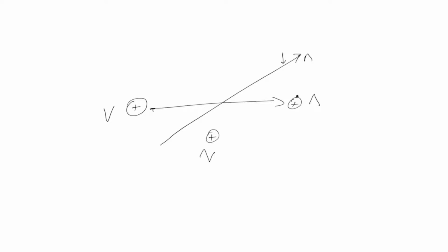On the other hand, when you look at this electrode, so let's just call them electrode A, B, and C. If you look at electrode B for this wave, you would notice a negative deflection, but it's not quite as intense. And lastly, if you look at lead C, notice that it's still perpendicular to lead C, and you would still follow this pattern.